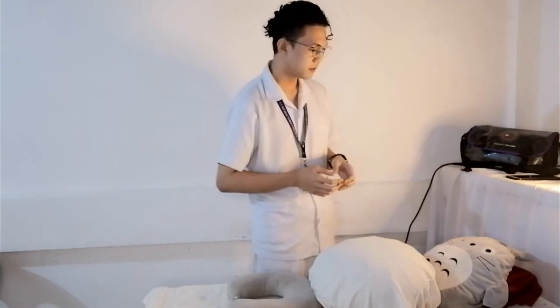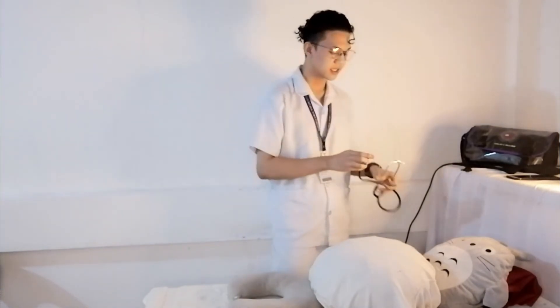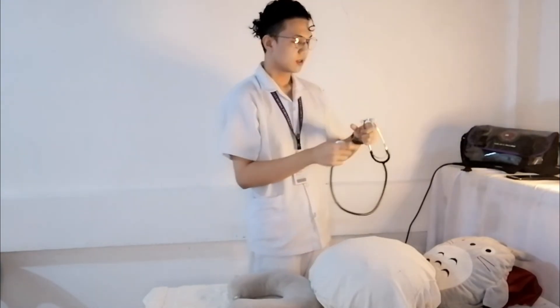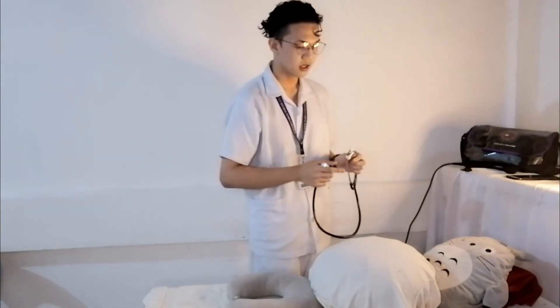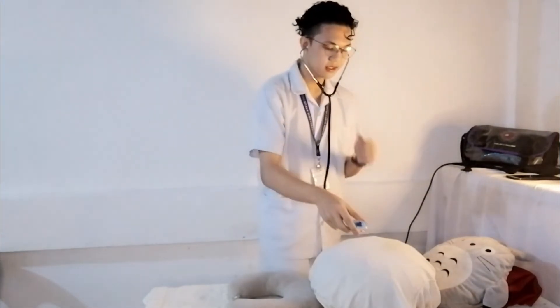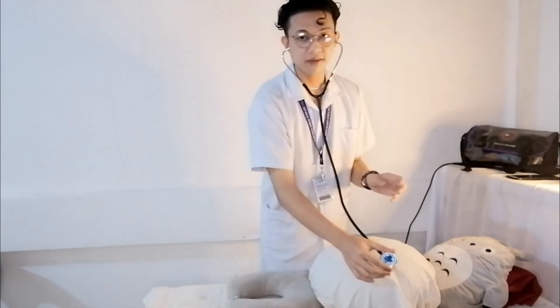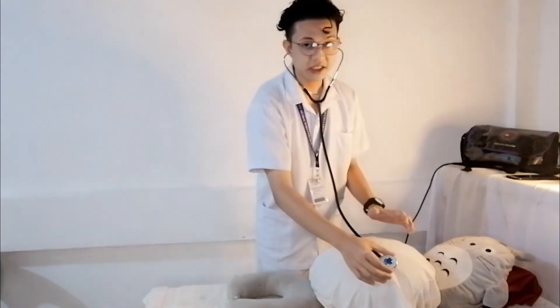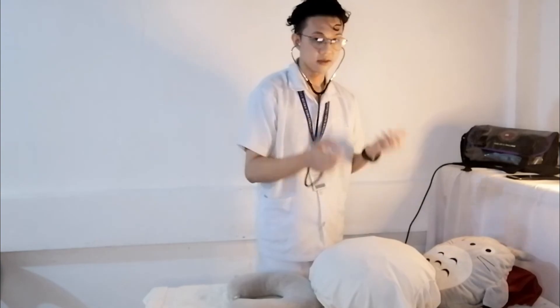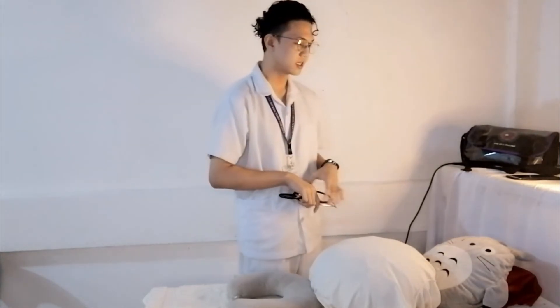We are done with Leopold's maneuvers for the fetal position assessment. Now I'll auscultate for the fetal heart rate. I warm my stethoscope and place it over the area where I located the back of the fetus during the second maneuver. I listen for one full minute and note the fetal heart rate. The fetal heart rate is 130 beats per minute, which is within normal conditions. I then note the location of the back of the fetus, which is on the left side of the mother, and inform the mother of the result.